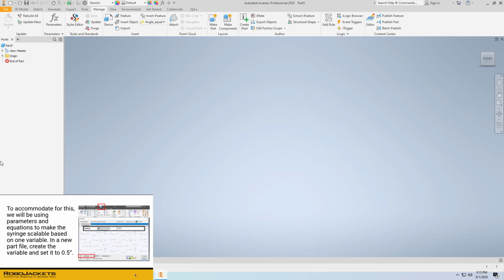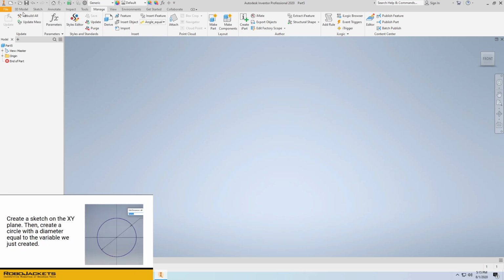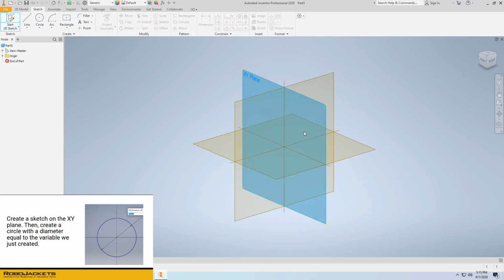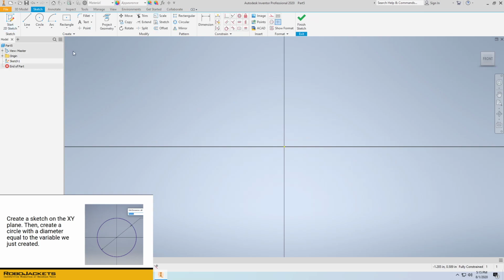From this starting point, we can now create a sketch that uses that new parameter. So go ahead and fire up a sketch on the XY plane and create yourself a circle. Except instead of giving it a number, we'll name it main dia. And you'll see it turns black there as it recognizes the value. So nominally it's half an inch, but the actual sketch is dependent on the parameter and will be updated if the variable changes.